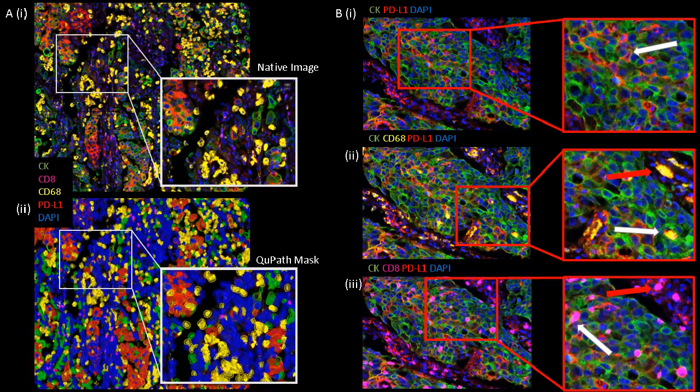So these are the numbers that we want to extract and compare to the clinical assessments or the digital pathology assessments. But as I've said, we can have these confounding cell types within the sample, and B2 identifies the CD68 macrophages which can plague the assessment. So the white arrow is actually pointing to an intrinsic PD-L1 positive macrophage inside the nest.